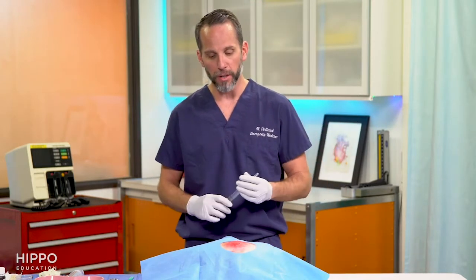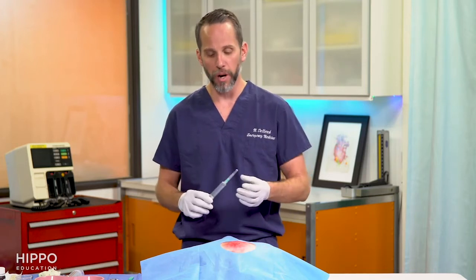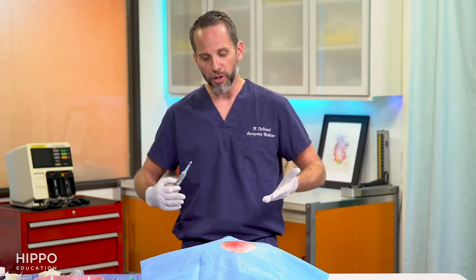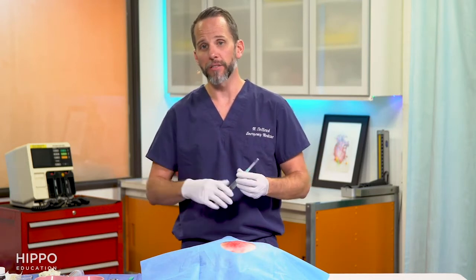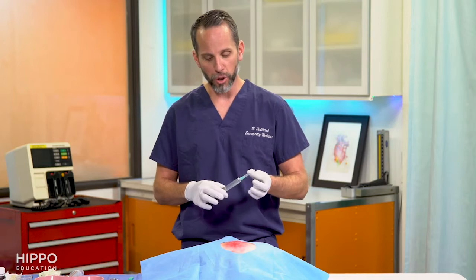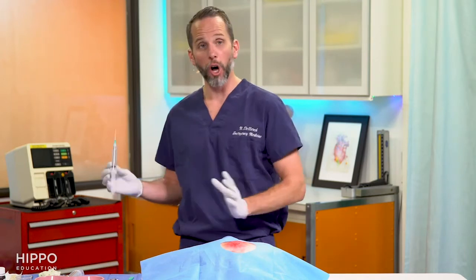The next step is going to be doing a field block. For this field block, I'm going to be using lidocaine 1% without epi. You can use it with epi if it's in the appropriate spot. But basically with a field block, you're trying to decrease the pain of the incision and really the pain of going into that abscess. So we'll try to do the best we can with our field block. This is going to be a 27 gauge long needle.